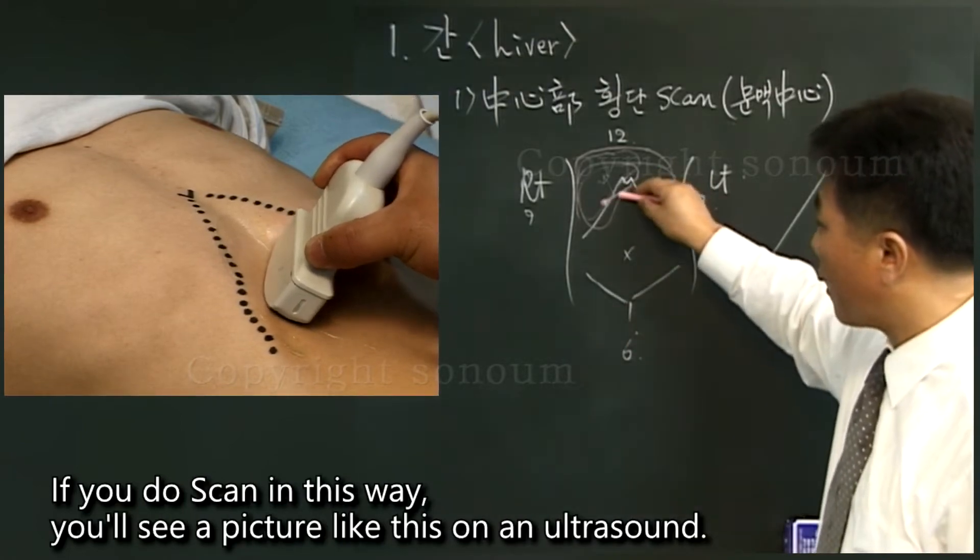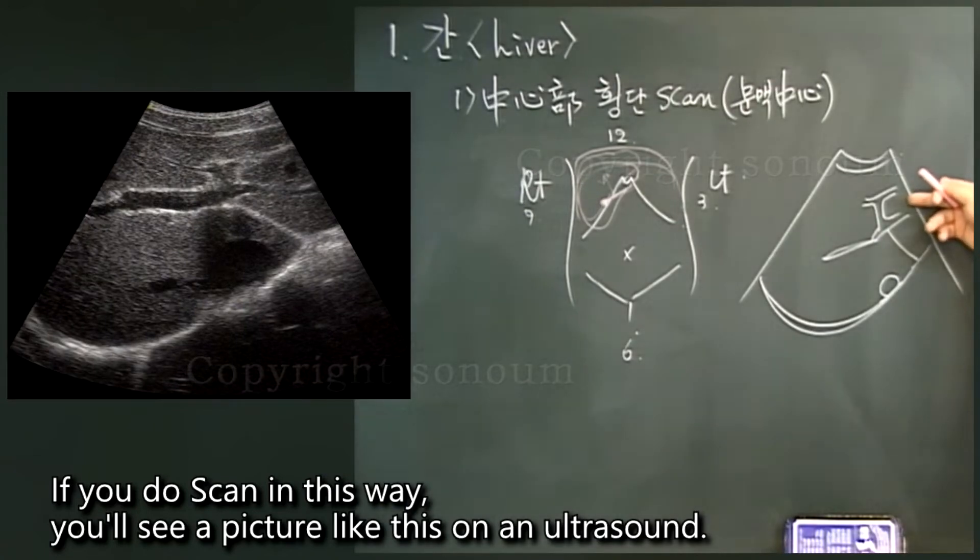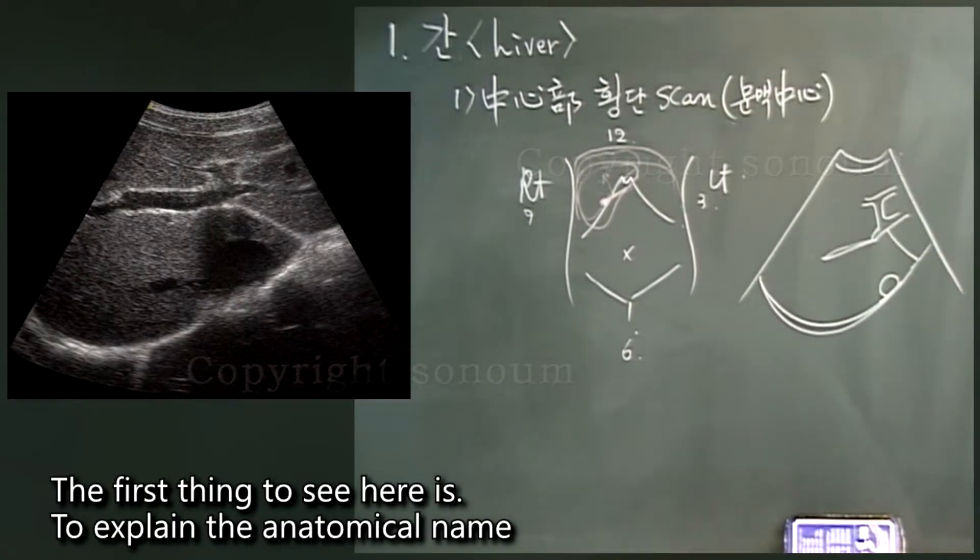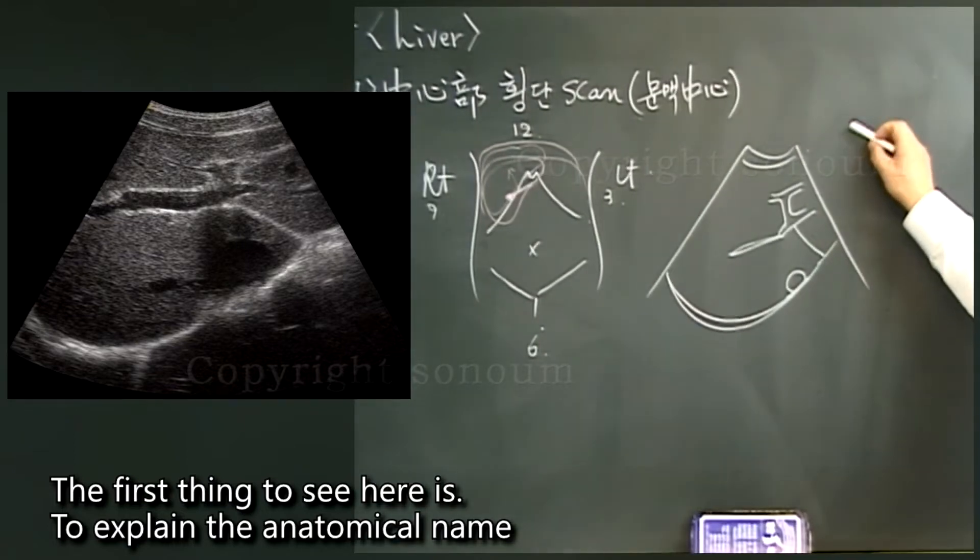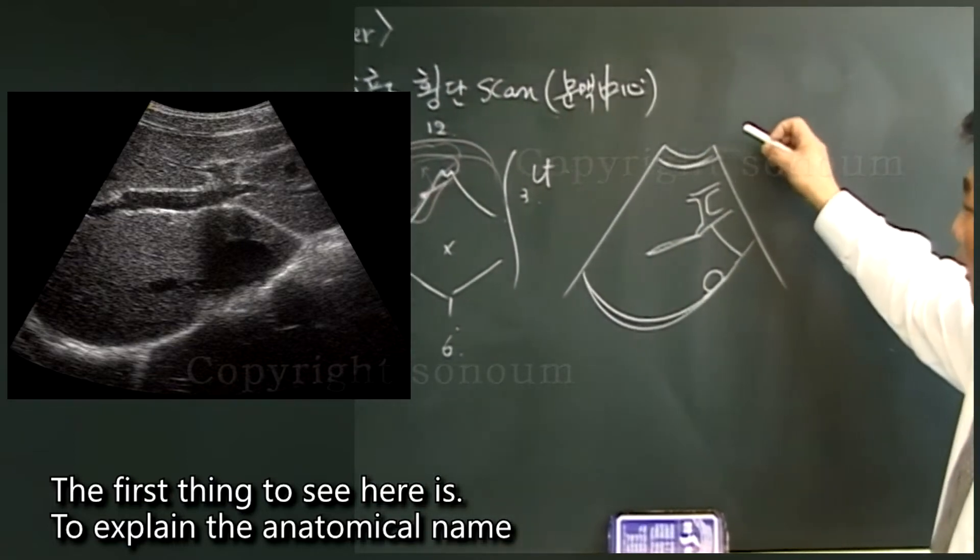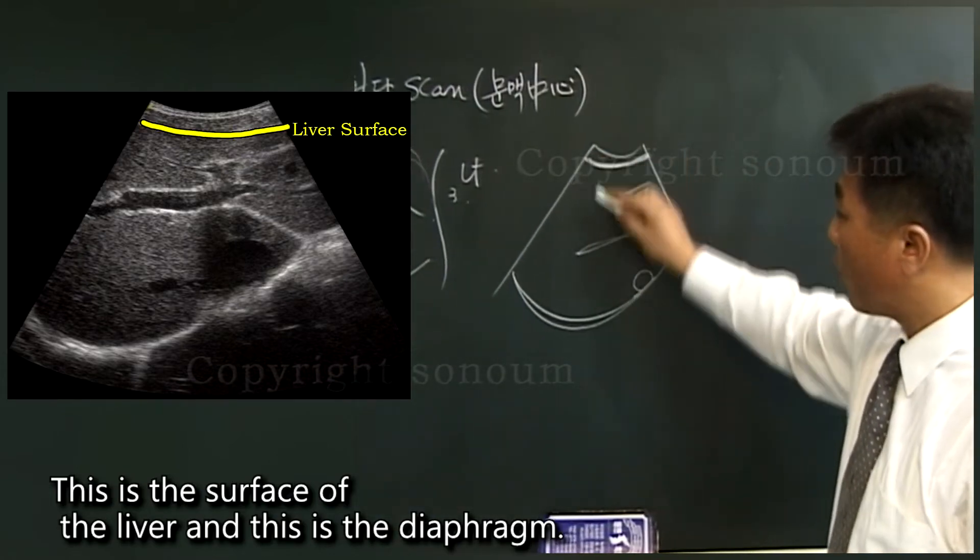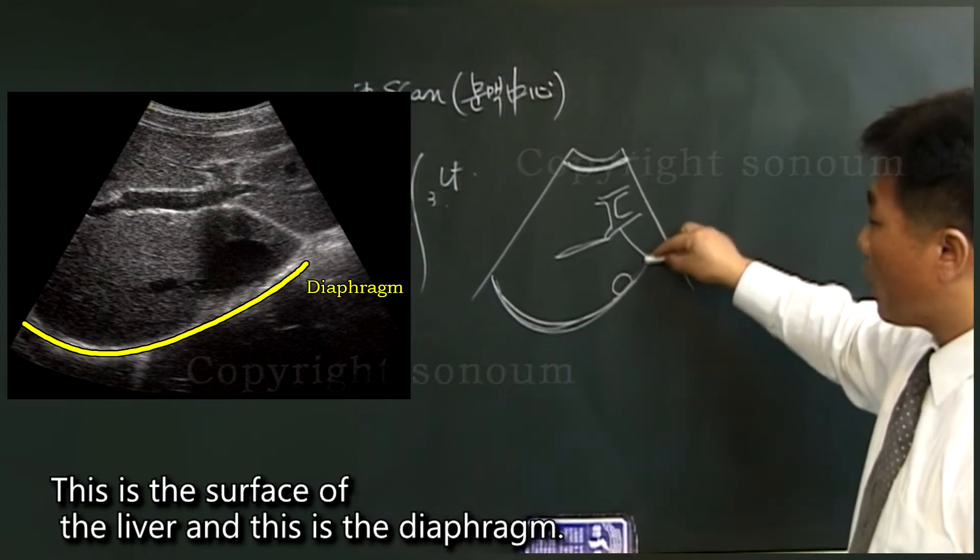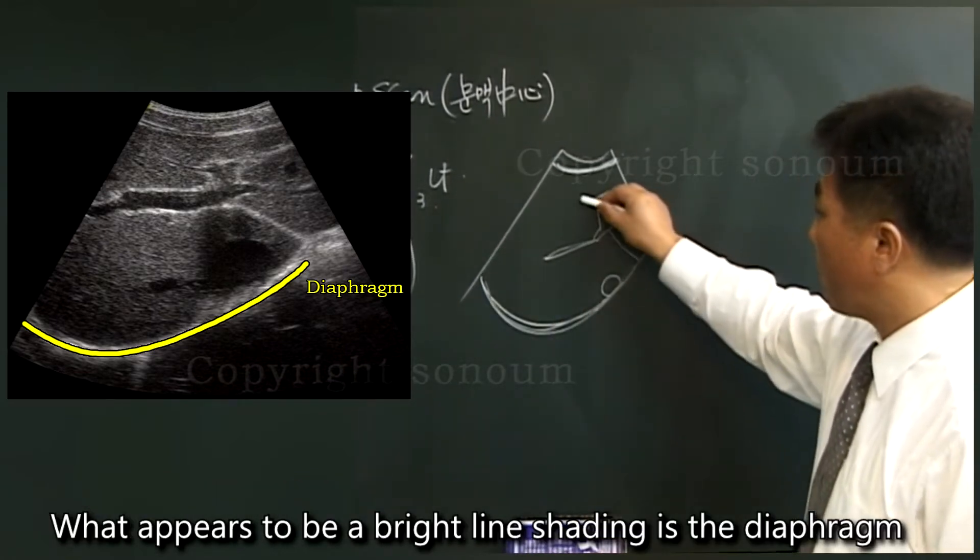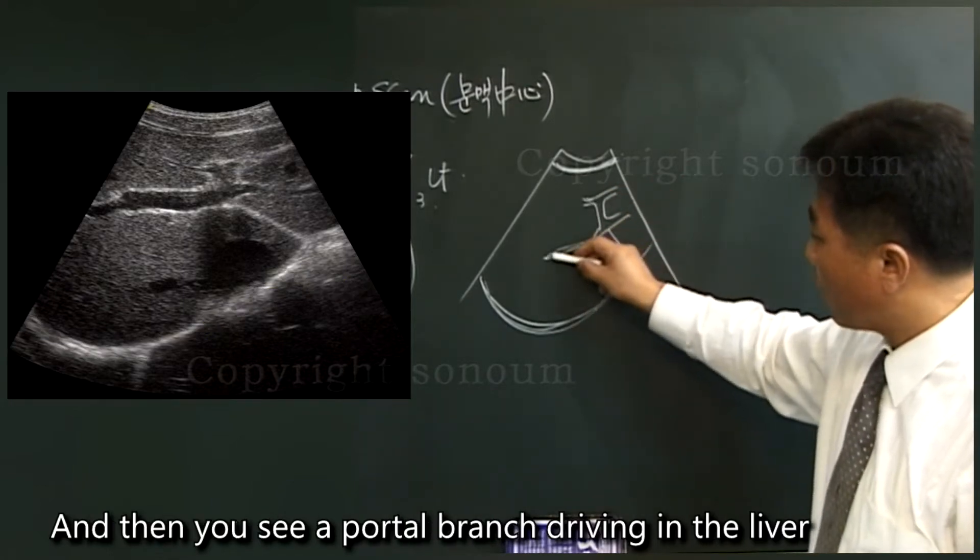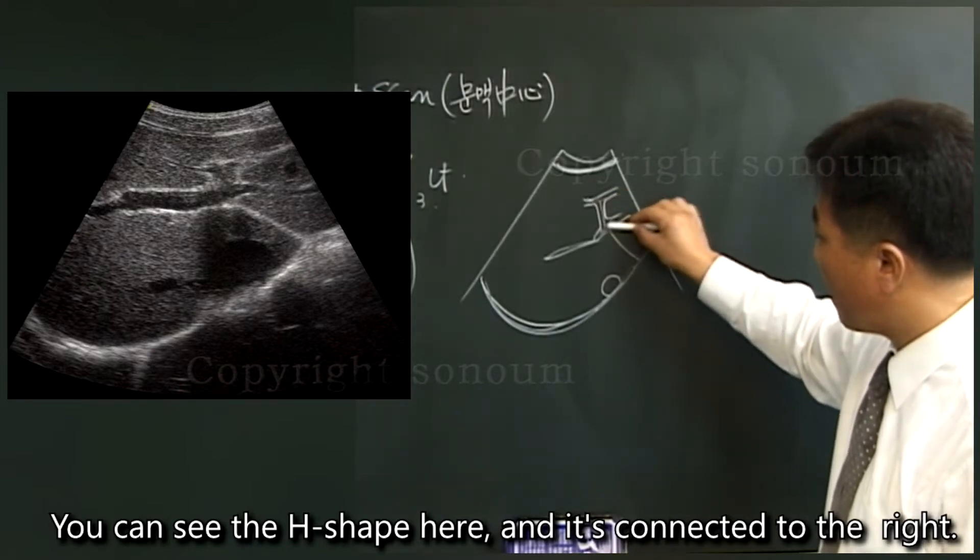If you scan in this way, you'll see a picture like this on an ultrasound. The first thing to see here is to explain the anatomical name. This is the surface of the liver and this is the diaphragm. What appears to be a bright line shading is the diaphragm. And then you see a portal branch driving in the liver.